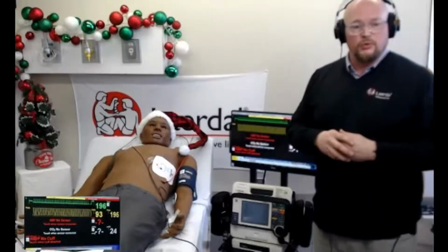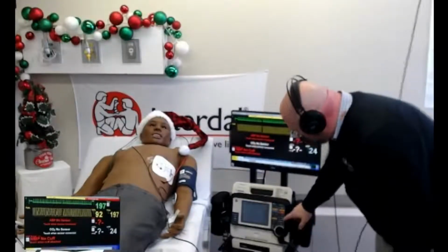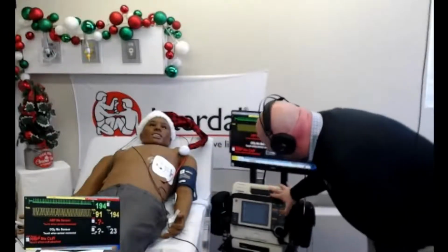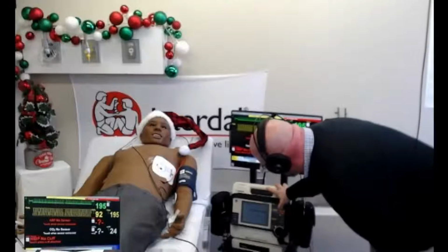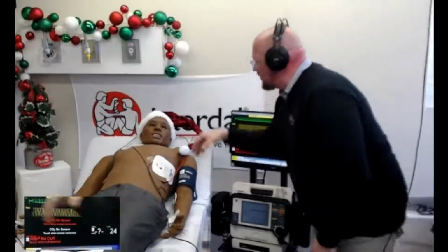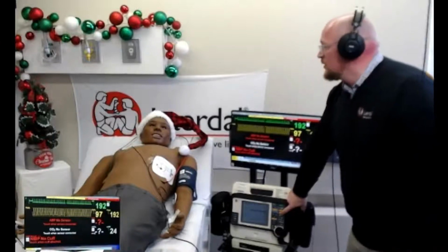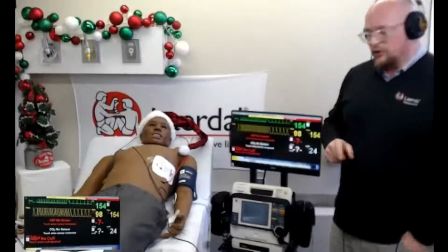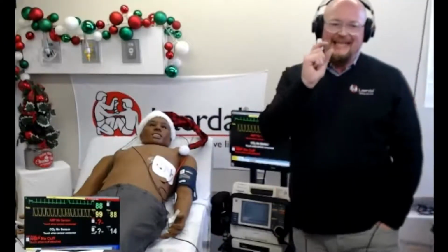I'm going to do a synchronized cardioversion at 100 joules, and again, follow your local policy. This is not medical teaching. This is for fun. We're going to shock him now. So I'm going to bring my energy down. I'm going to do 100 joules. Charge. My defib cable and everything is connected, everything's good. No bed contact, everybody's clear. And shock delivered. Shock delivered is recognized. I have this scenario so that once it recognizes a shock of 100 joules, he feels better now. Yay. Even though I didn't give him much sedation for that shock, he probably would have been a little bit madder. Cold turkey.